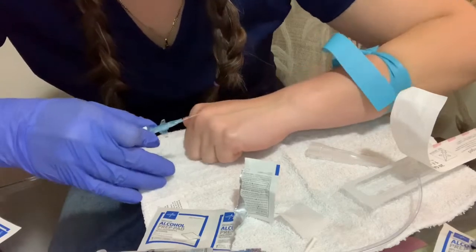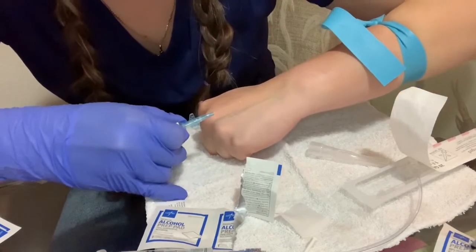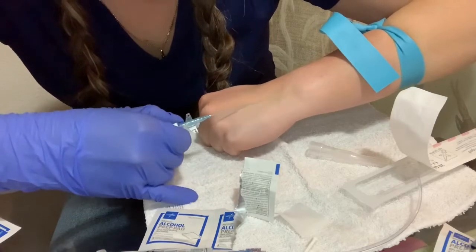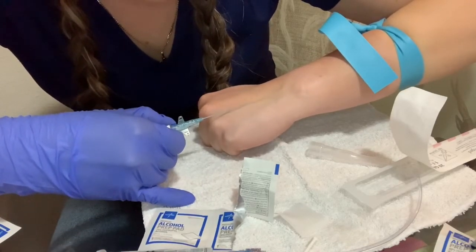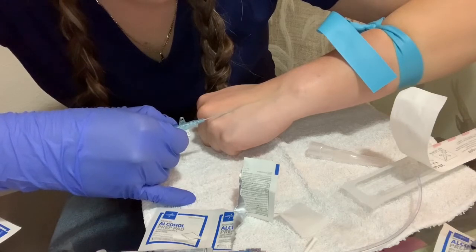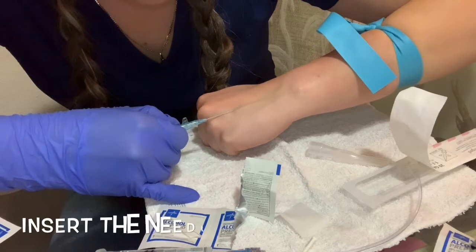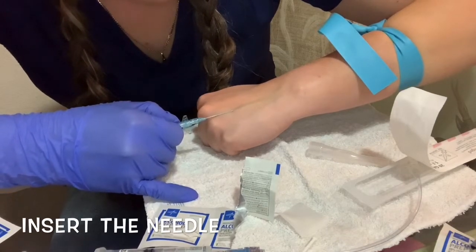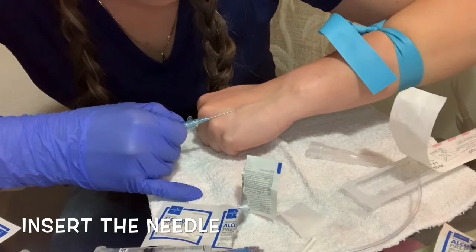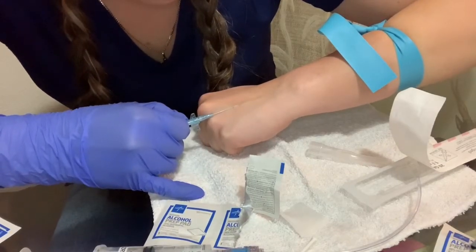I have a good vein on my hand. I'm making a fist so I can get the vein straight. One thing you can do is always pull the skin down so you can keep those rolling veins in place and they don't roll.